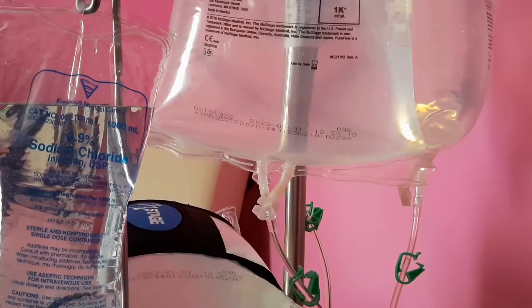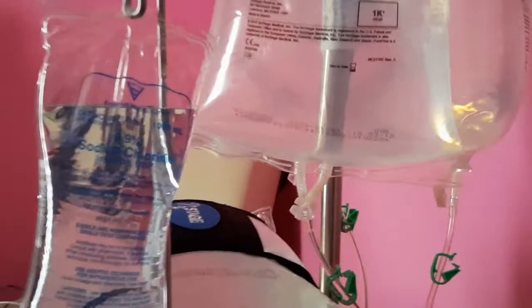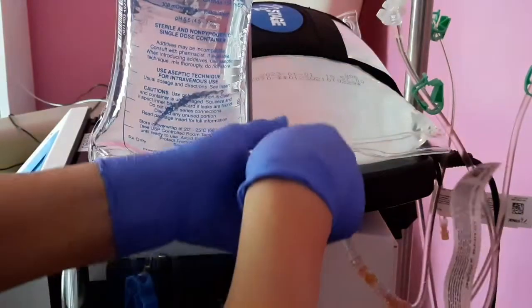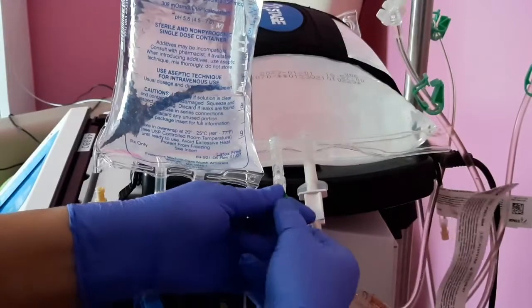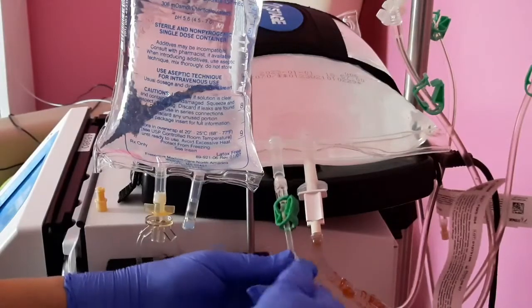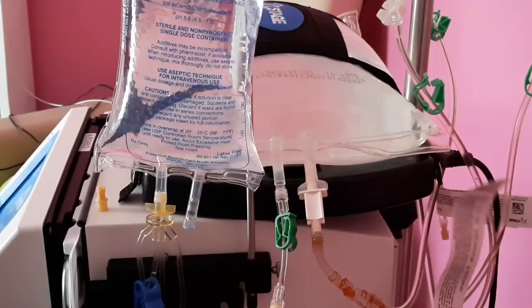Now, there's one more line. We have one more frangible that we have to break, and that's the one on the warmer bag. So, again, hold the top, push in here, click, push towards you, okay? You want to prime that line, you can: you unclamp, loosen, and clamp back up until you're ready for it, okay? So, we're done with that.